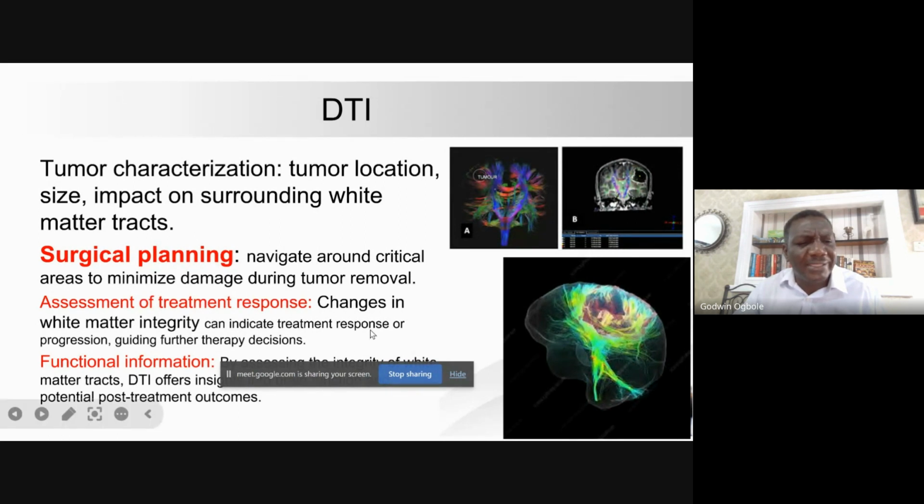and it also provides you with the patterns to actually look at white matter integrity and give you some additional information as well about the diffusibility or integrity of the white matter fibers.